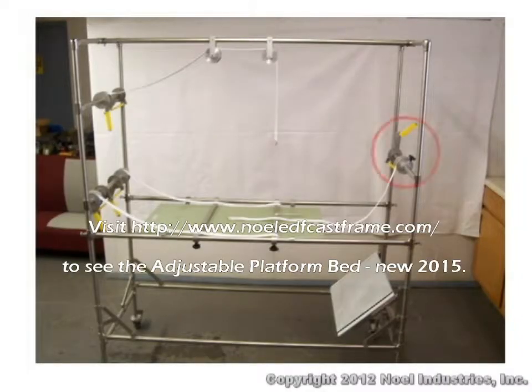Once prepped and ready for the procedure, the young patient is attached at four specific points to the ratchet straps that provide elongation, derotation, and flexion.